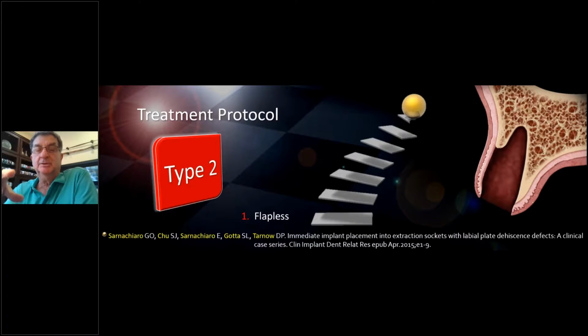But here's another technique for certain cases, and that is to combine the type 1 procedure that I showed you with the type 2 procedure with the membrane. This is Guido Sanacchiaro, one of my partners, who came up with this combination. He said, biologically, this makes sense, Dan.